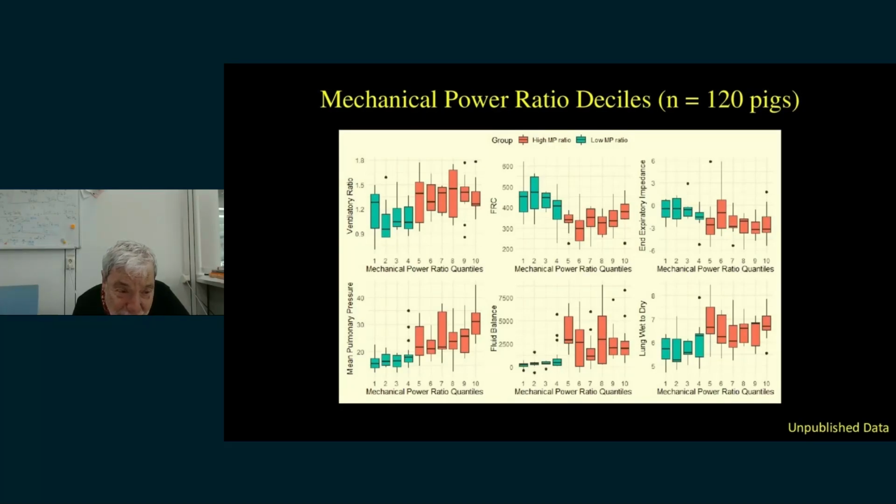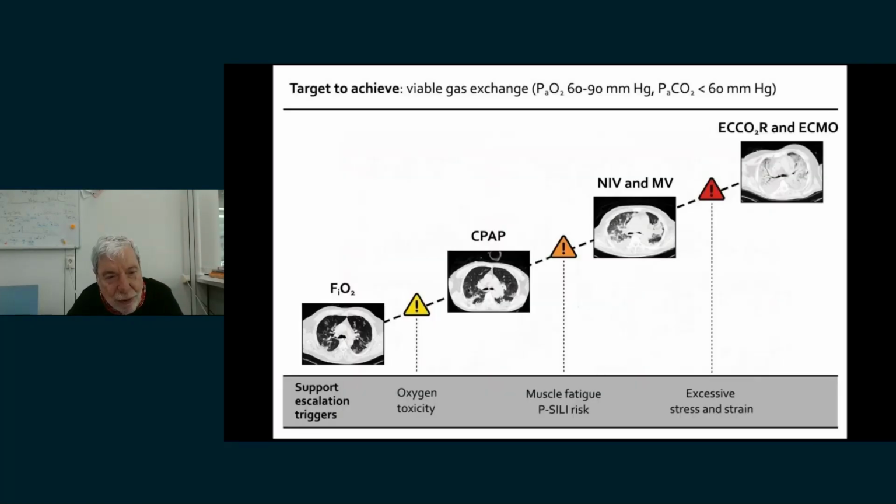This is fluid balance, this is mean pulmonary artery pressure. You have a sort of threshold. That means total ventilation, expressed also as a possible threshold, is not perfect, but it is a way to look at it and to organize mentally, saying, okay, it's 3-4 times what I expect. I have a tremendous problem.